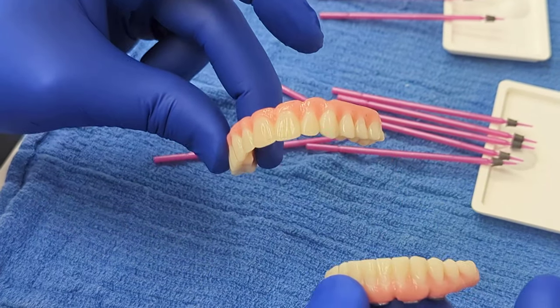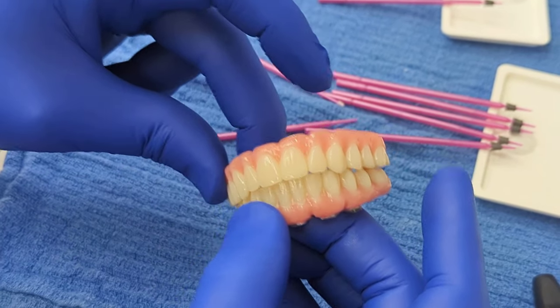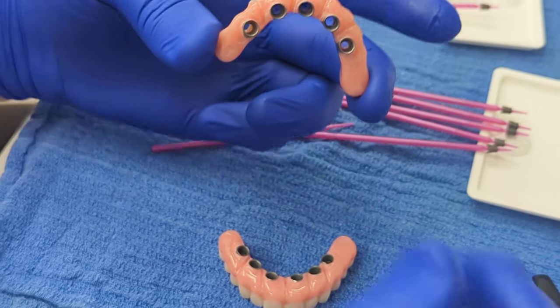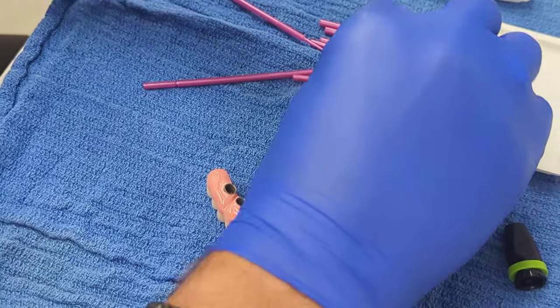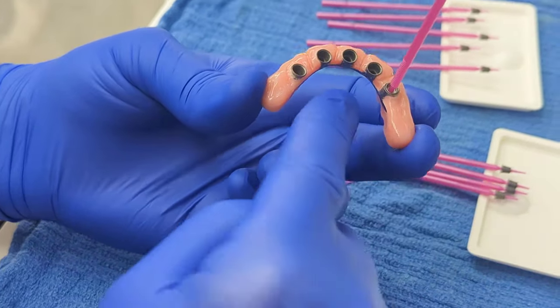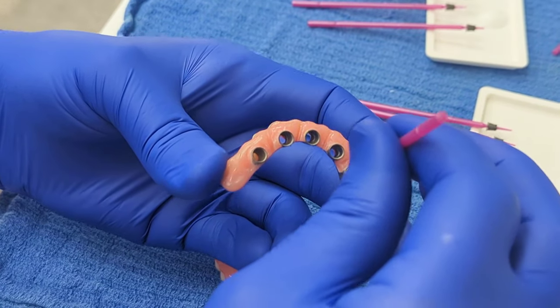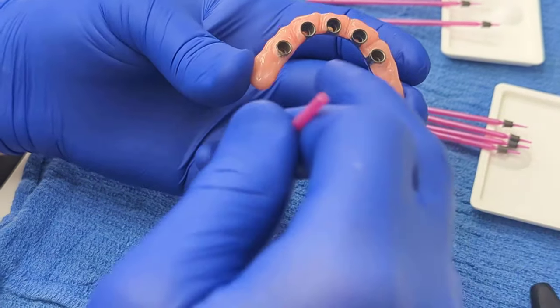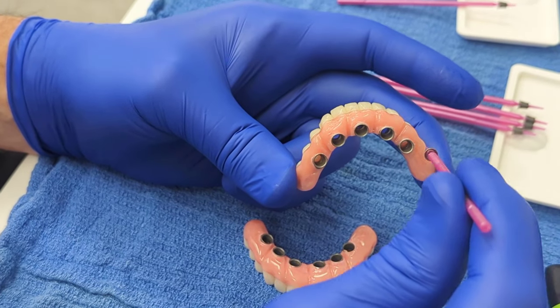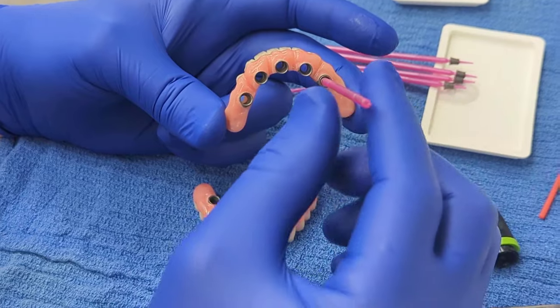These teeth can wear over time, but if they can't wear, then the stress of that function gets transferred to either the shoe, and again, I call this a shoe, but you know, if you think about it, this shoe cemented within metal is a metal-on-metal bond, which is a much stronger bond than a metal-on-zirconia bond. So if this was a zirconia restoration, this bond strength would be a fraction of the bond strength that it's going to be on this patient.